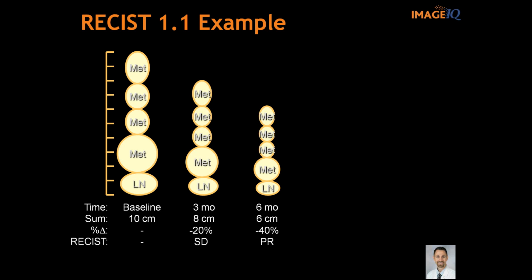It's certainly not a complete response. They still have disease here, but they're at partial response, which is good for them. Let's move forward in time here. Maybe I'll use this as 9 months. This could be much further down the line, potentially.